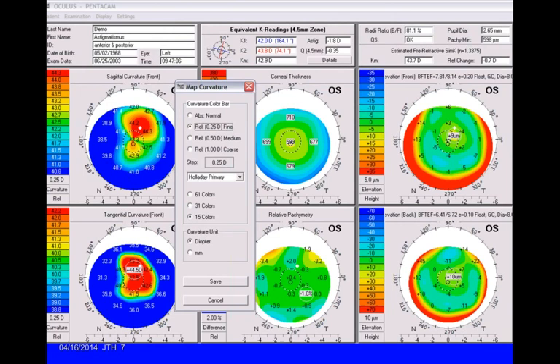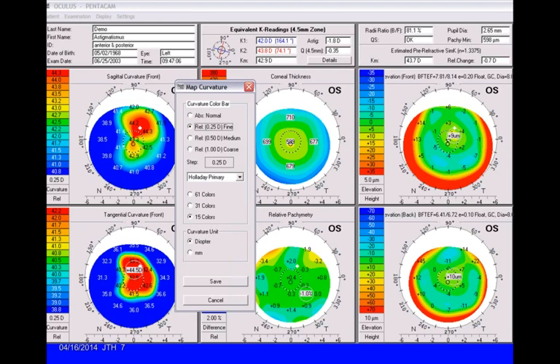On the first page, I show the map curvature scale. Most of the time, I tell doctors that when selecting the setup, we have something called the Holiday primary color code. This allows you to best set it on fine with 15 colors. The reason 15 colors are best is that if you go from dark blue to dark red, you can't really perceive more than about 15 colors of resolution. As you go to 31 or 61, you can't tell the difference between two yellows, so when you look on the map, you really don't know what power that is. Fifteen is the best—it gives you the primary colors and lets you see things well. Most of the time, doctors work in diopters, not millimeters.